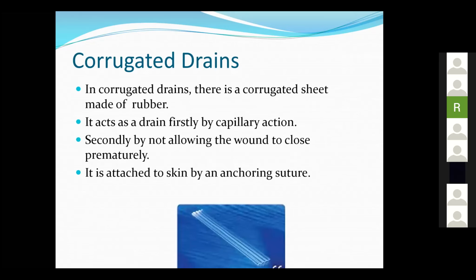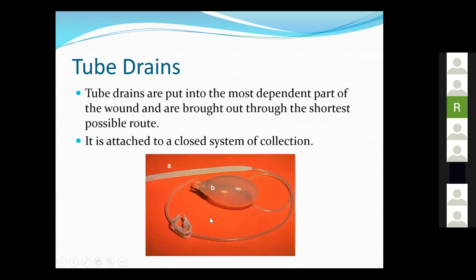And we suture them and keep pulling the drain out slowly so that the top starts to heal easily. The tube drain, again, can have this bottle. It has small, tiny openings in the entire wound. You may not have tiny openings in the entire wound. You can have openings only at the tip, like in the nasogastric tube.